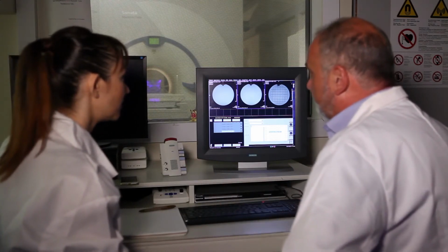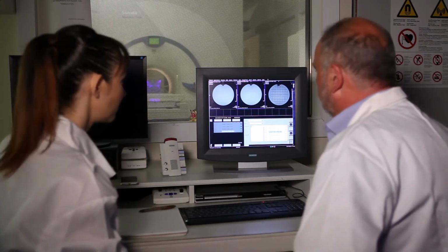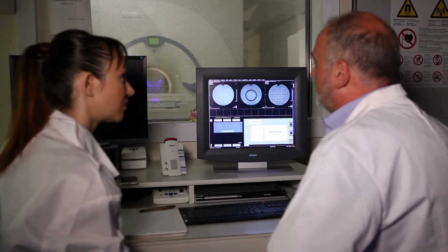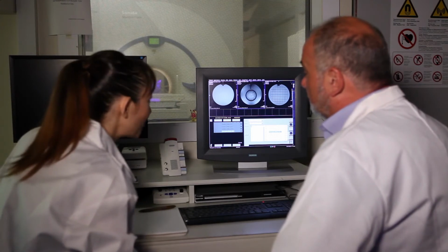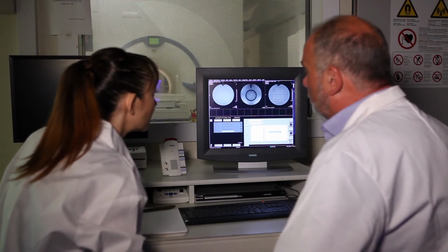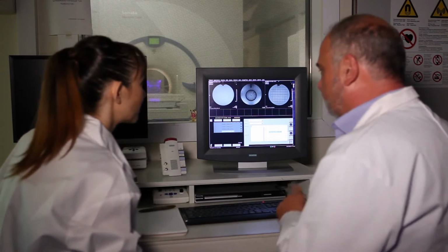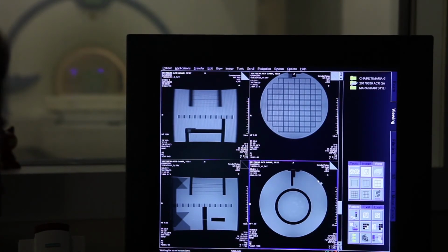This is the point where you can measure the SNRs, that's the other part. Actually we're at the center of the phantom now, right? And this is the most important part of this phantom. You are able to visualize small holes here, if you can see them. See? I can now see them. These small holes deal with what we call low contrast detectability, low object detectability. And this phantom is famous for this facility: being able to see, for any sequence you want to design, the low contrast detectability. So this is an ingenious design.